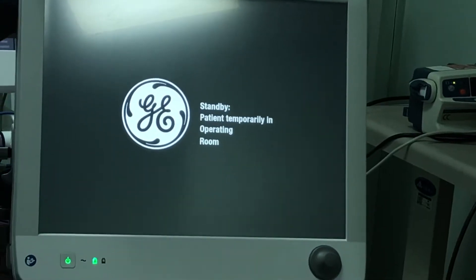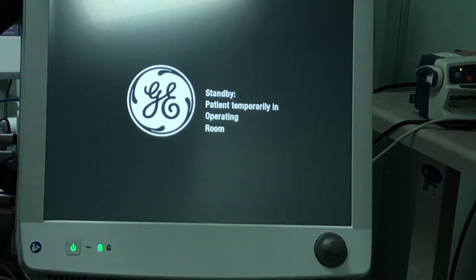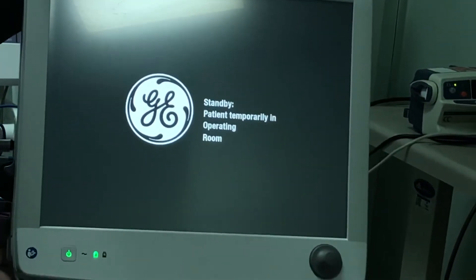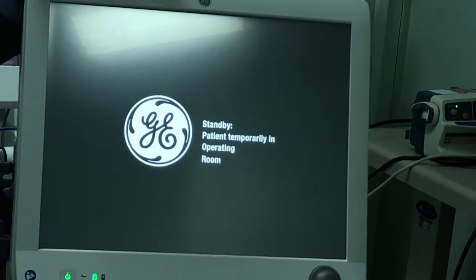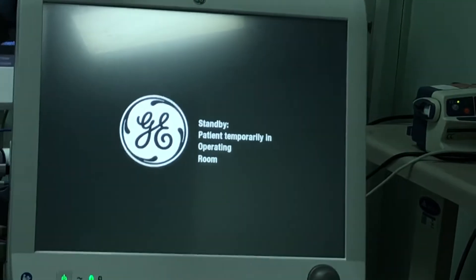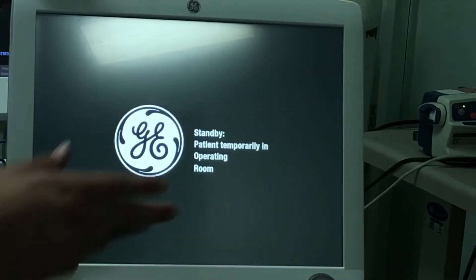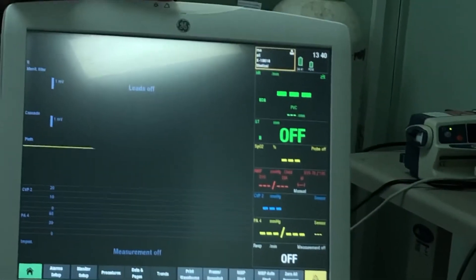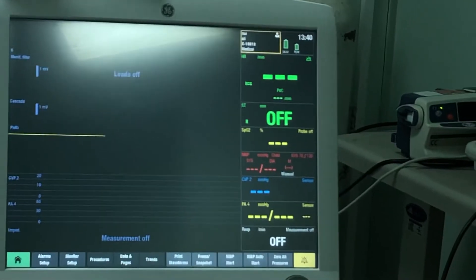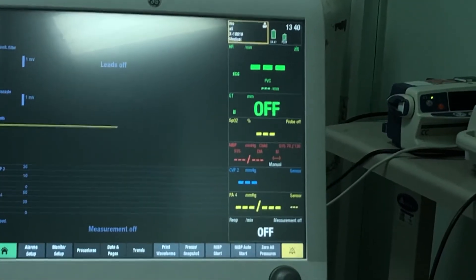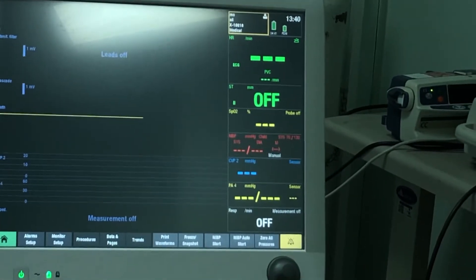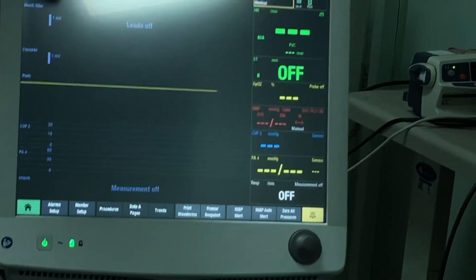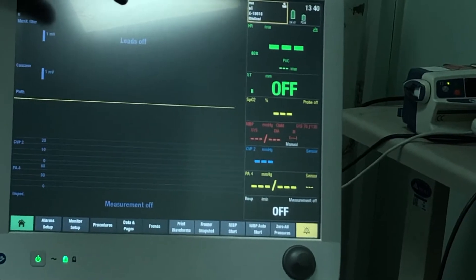The monitor will be on standby — it will not be functioning, it will not be alarming, it will not give you a headache. Once you actually have the patient, you just touch the screen and it will be operating again. Keep it plugged into electricity and on standby when there is no patient connected.